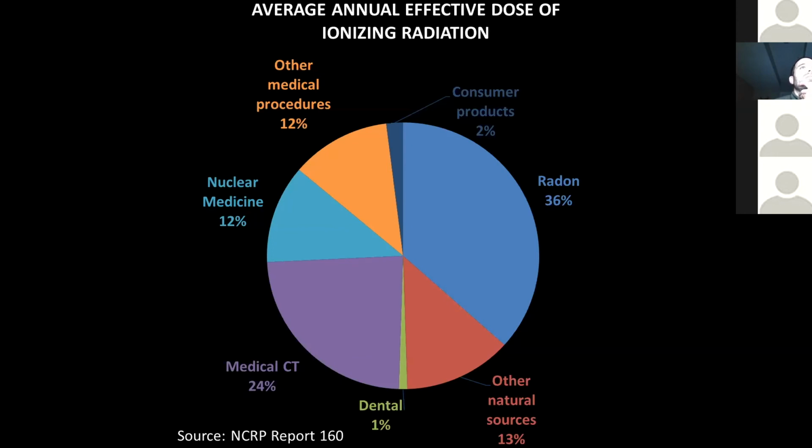But to answer this question, for every scan or any image in a dental office, you have to have a reason to take that. It might be implant planning. It might be orthodontic planning. It might be an endodontic problem. It might be pathology. Each one of those might have a slightly different image quality concern. So you match the image quality to what you expect you're going to find based on that specific scenario. Now, if there's a surprise finding, you may elect to go back and do some additional imaging to get more information or more detail. We could discuss that at a different time.